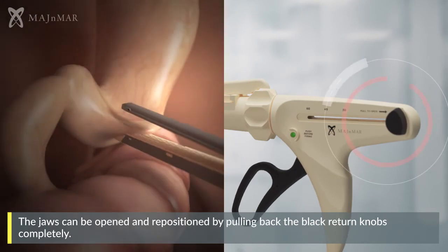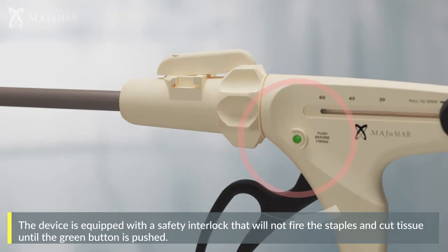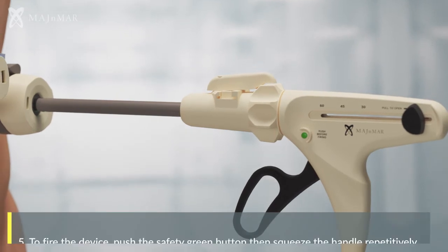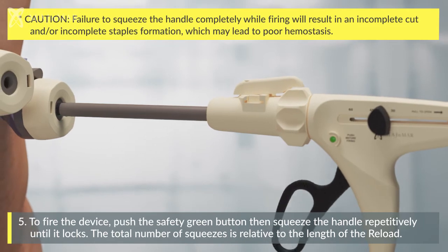The jaws can be opened and repositioned by pulling back the black return knobs completely. The device is equipped with a safety interlock that will not fire the staples and cut tissue until the green button is pushed. To fire the device, push the safety green button, then squeeze the handle repetitively until it locks.